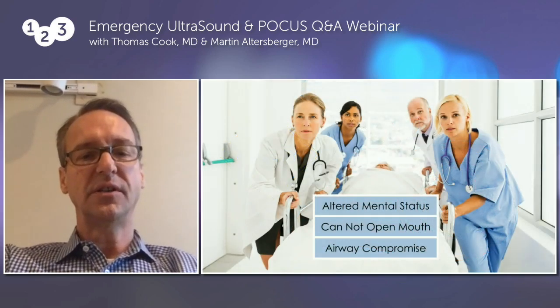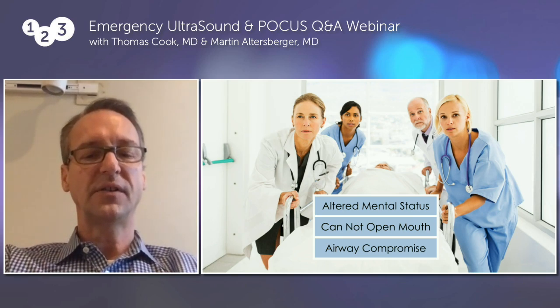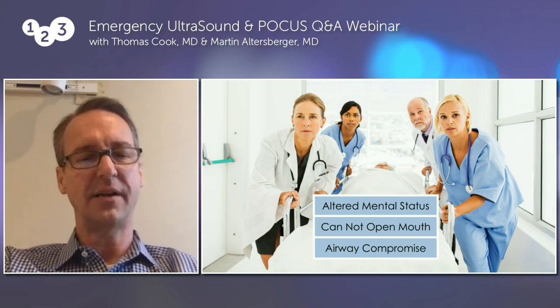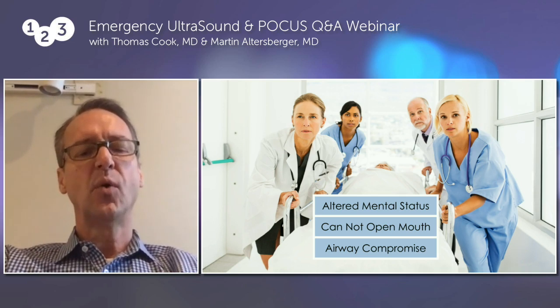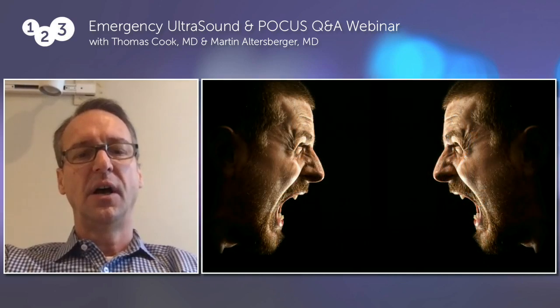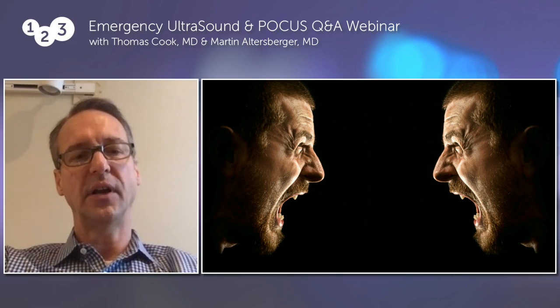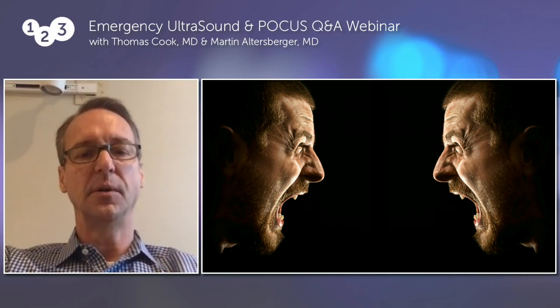Now, there are going to be situations where you just can't do it in an emergency department. I can't do it in my setting if they have altered mental status or they have so much trismus they can't open their mouth. The patient I did 10 days ago had a lot of trismus, but we were still able to get his mouth open far enough to accomplish our procedure. Or you really think that their airway is so unstable that it's too risky to do as an outpatient. The other thing is that they have to be able to cooperate. If they're really upset or they're having a lot of pain or they can't hold still, then you're not going to be able to do this in an outpatient setting or in the emergency department.